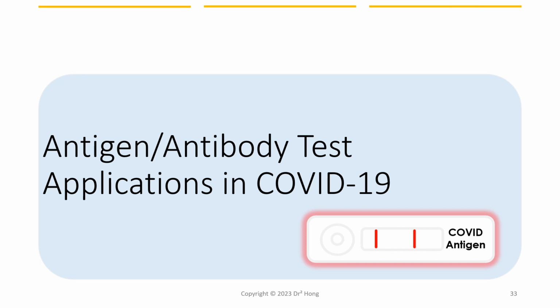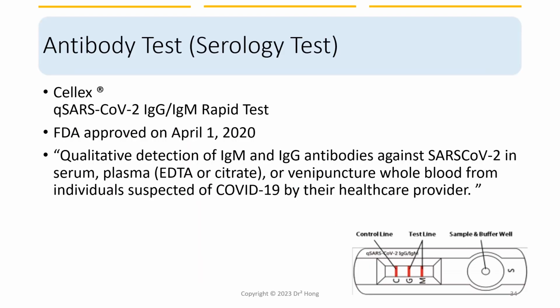And I'm sure without me saying, this is by far the most commonly used lateral flow assay since spring 2020. During the early phases, which was around April 2020, an antibody test LFA quickly became available. Now, it could test the presence or absence of IgG and IgM specific to the infection.